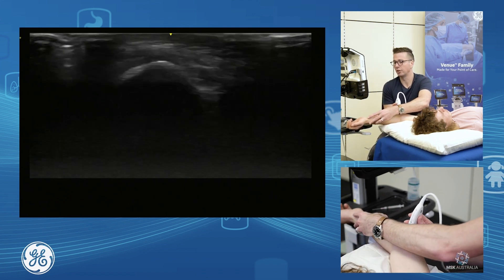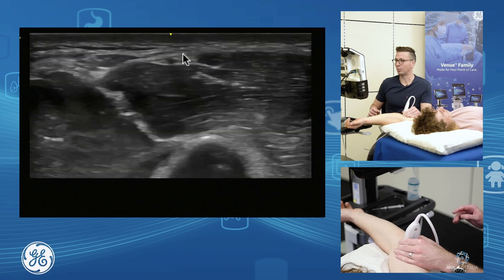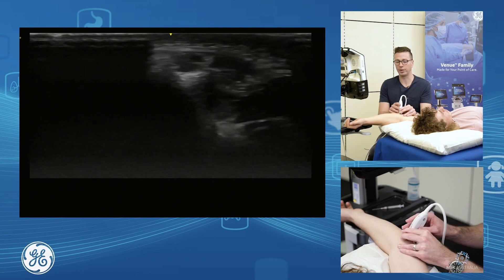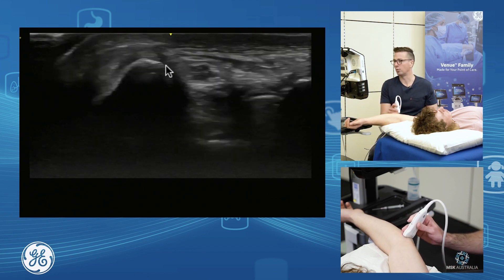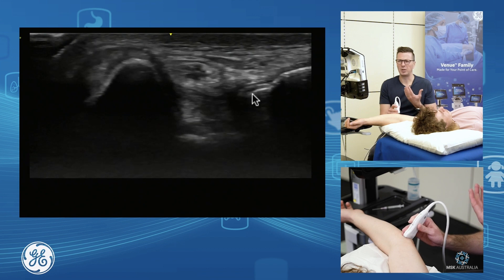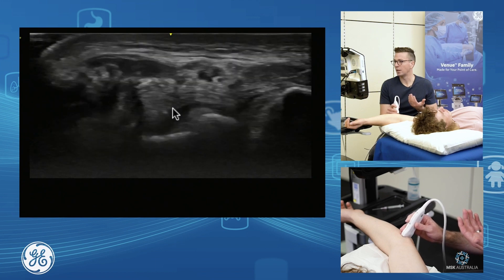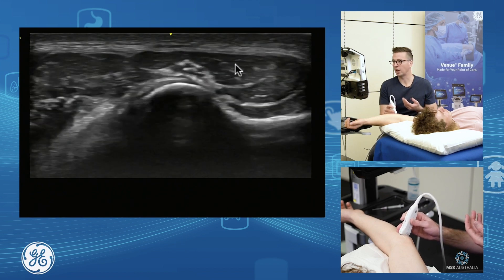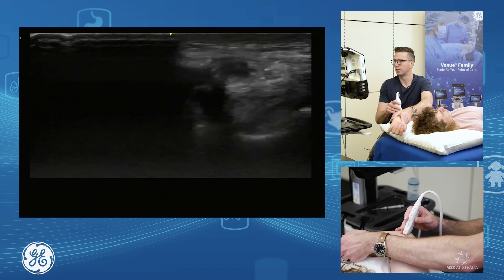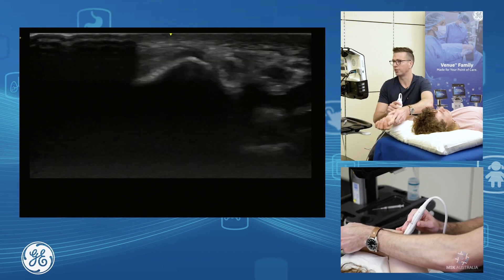I put him into a bit more extension as it clunks back into position. We grab in through here, track proximally, and we can see the ulnar nerve sitting up in through here. As we scan up towards the distal end we can see it in the ulnar groove. We're also assessing for loose bodies, joint pathology, and the deep band of the ulnar collateral ligament. Then we follow the nerve down between the two heads of flexor carpi ulnaris. It can sit within its groove, or it can dislocate and snap back in.